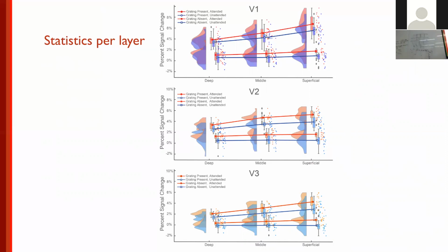So what we do find is towards the surface, I think you still wanted to discuss which axes should go where. Well, in my case, that is activation and towards the superficial layers. So we do find this increase towards the superficial layers, and we find it mildly for an attention effect, clearly for a stimulus effect.